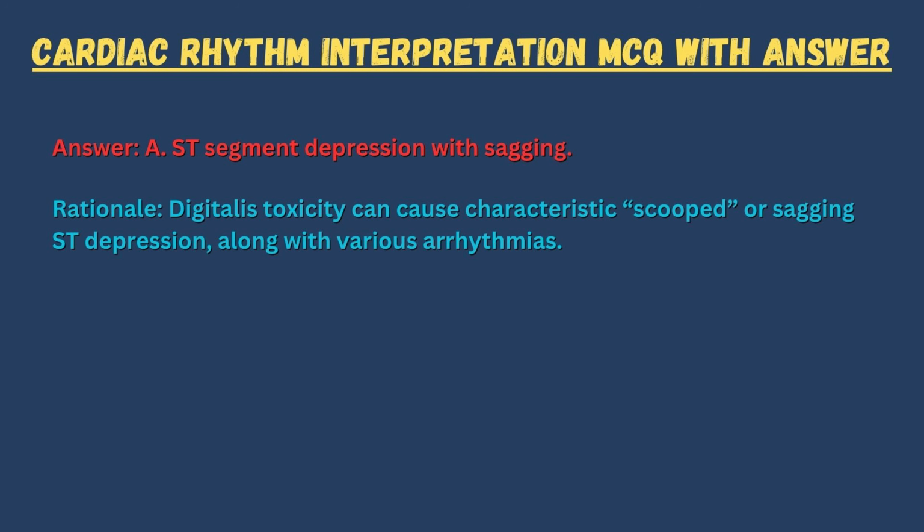Answer: A. ST segment depression with sagging. Rationale: digitalis toxicity can cause characteristic scooped or sagging ST depression, along with various arrhythmias.